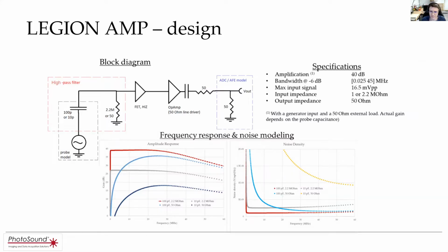You need lots of elements which are getting smaller and smaller, and then they won't have as much capacitance. So it allows you to work with more and more elements and more channels.